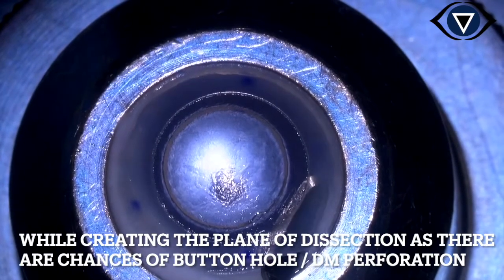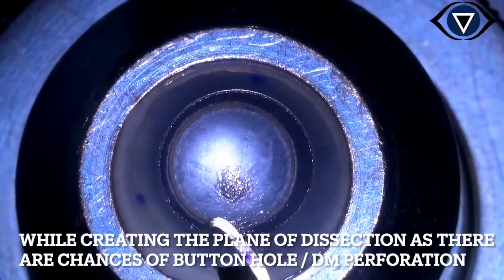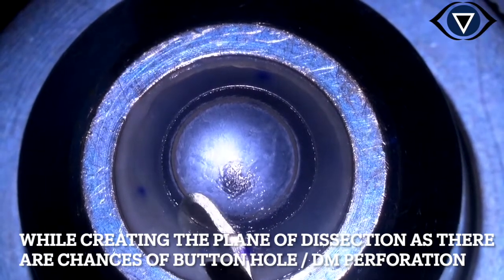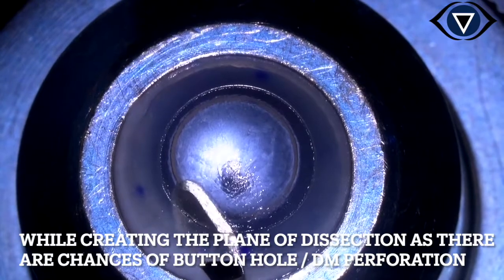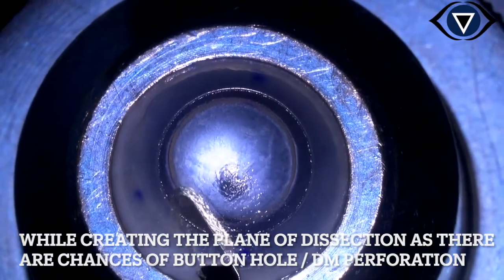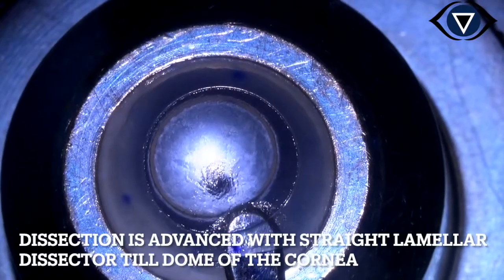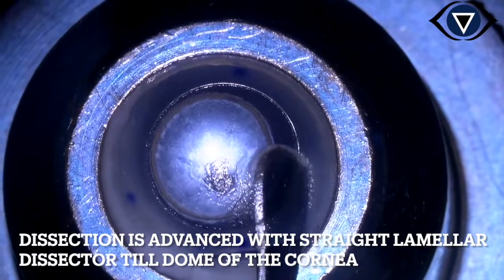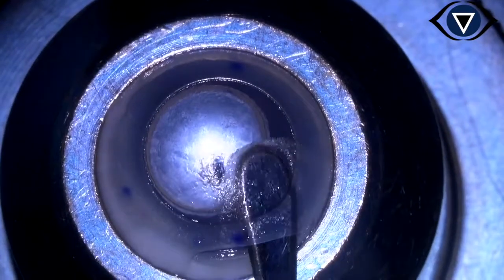We have to be careful while creating the plane of dissection because there are high chances of buttonhole or Descemet's membrane perforation because of this differential thickness in the center and periphery. The dissection was advanced with a straight lamellar dissector till the dome of the cornea, like it is done while harvesting a normal DSEK tissue.